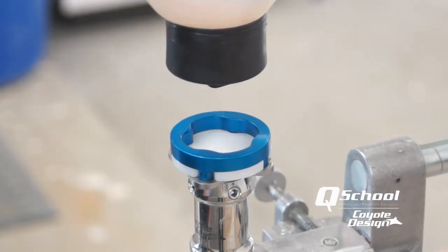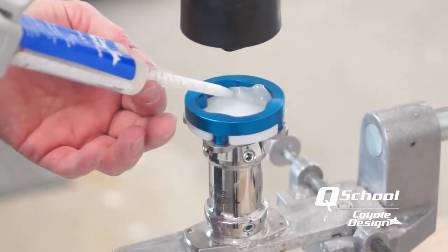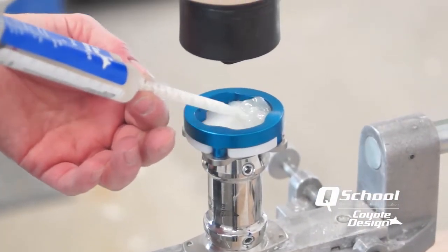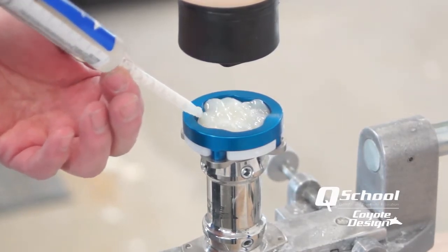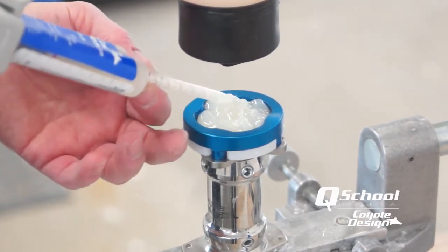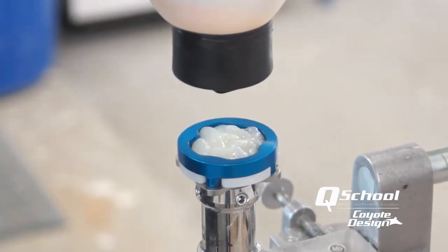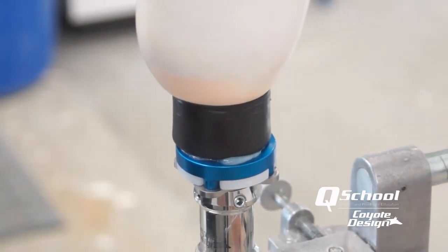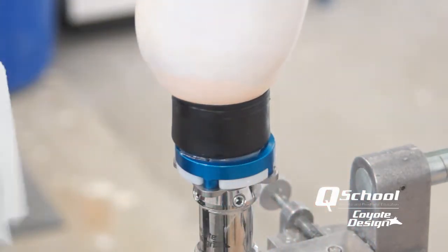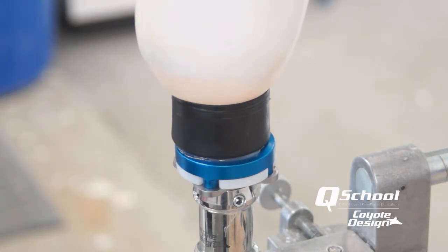Now we've got everything set up where we want it. We'll take our Coyote Quick and fill in the void in our connector. I try to lay that in there without leaving any open areas. Now we'll drop everything back into place. A little bit of excess — just wipe that away and as soon as that sets up we are ready to remove it and continue on with our lamination, which takes roughly three or four minutes with Coyote Quick.